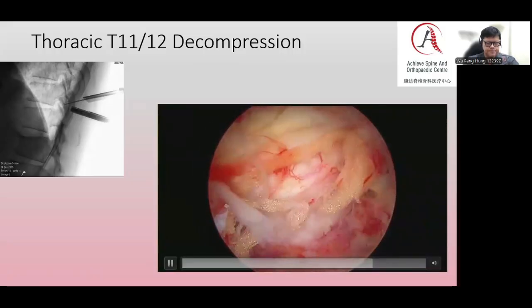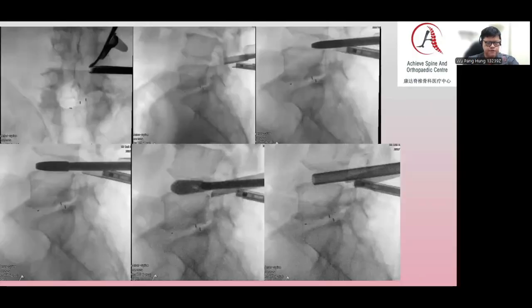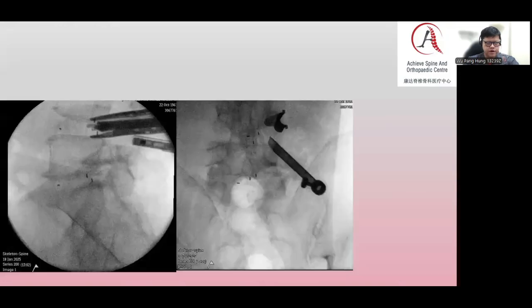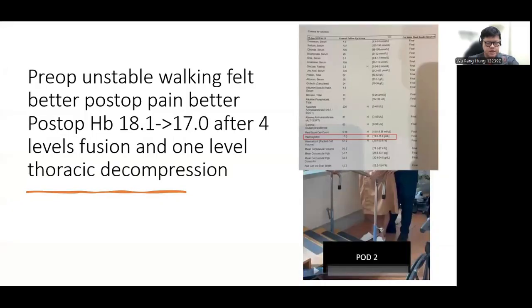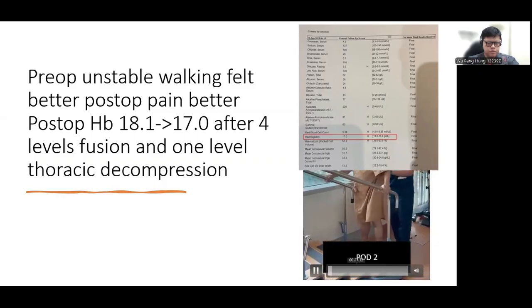Nevertheless, we did decompress and then went on to do a fusion, starting from the right side L5-S1, then the right side L4-5, then we do the left side L3-4, followed by finally L2-3. So these are the post-op results. The patient has significant improvement in terms of mobility. He actually walked on post-op day 1 already.